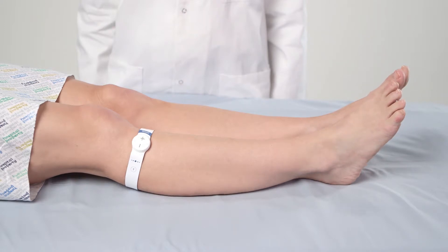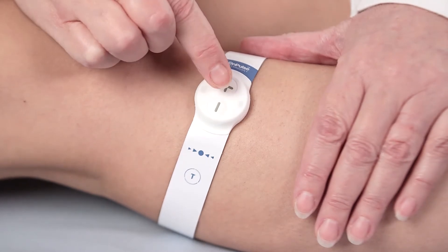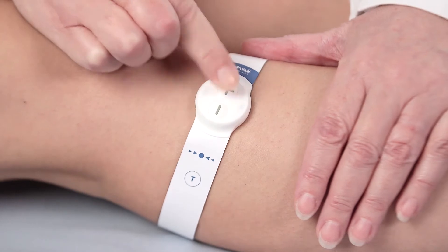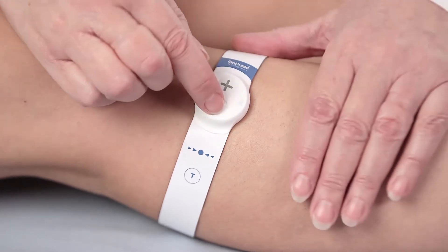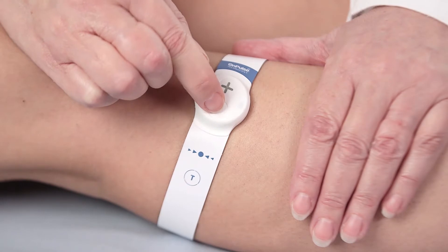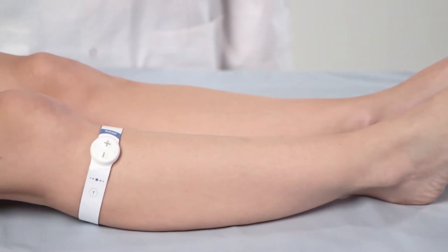To accommodate any variation in stimulus due to leg position changes, simply turn the setting up or down. There are 11 stimulation levels in the Gecko device. The settings are indicated by the number of flashes in sequence from the LED lights while the device is in operation. In most cases, levels 4 or 5 are ideal. To reduce the levels one by one, use a short press of 0.5 seconds of the minus button.